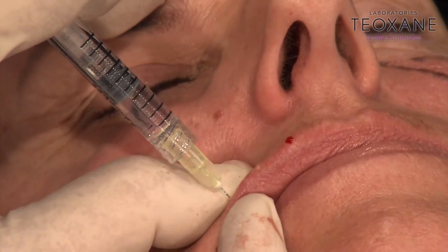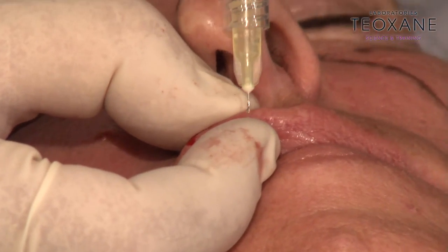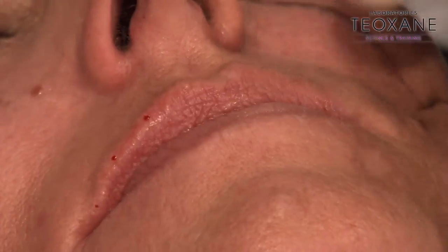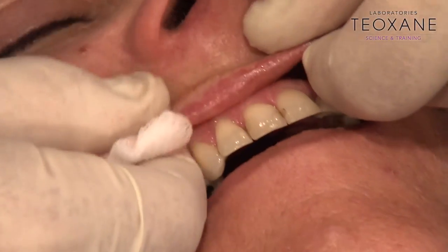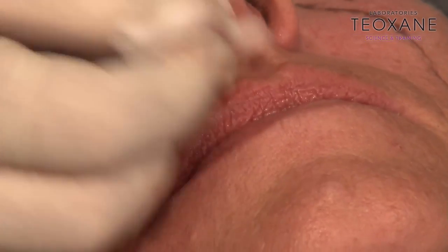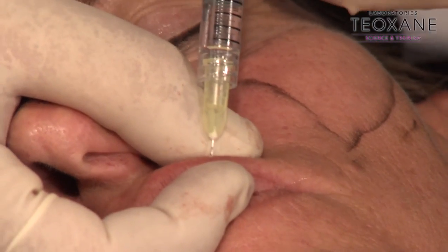Voilà. You can see that. Voilà. It's a bit uncomfortable for me because I don't have the good light. So I don't really see what I'm doing, but it's fine. Open your mouth. You can see you can adjust your filler by doing this. You reset the filler in the outline properly. You see you have a little dent on top. That we're going to do that with a different filler. Alors, RHA 1, yeah, get ready.